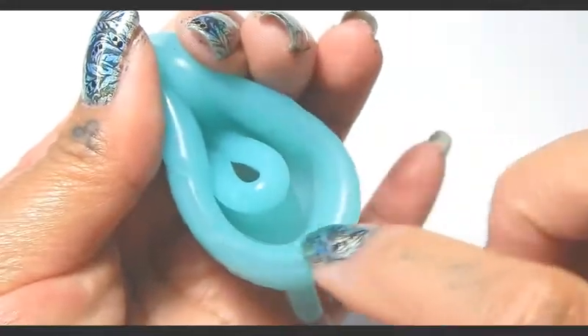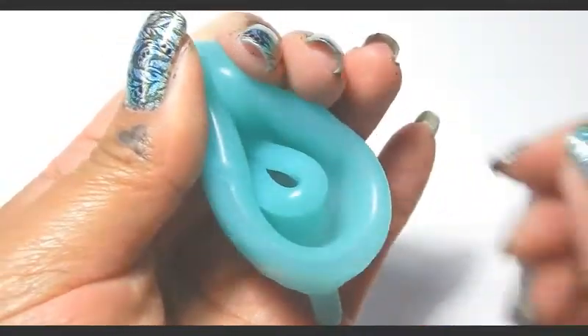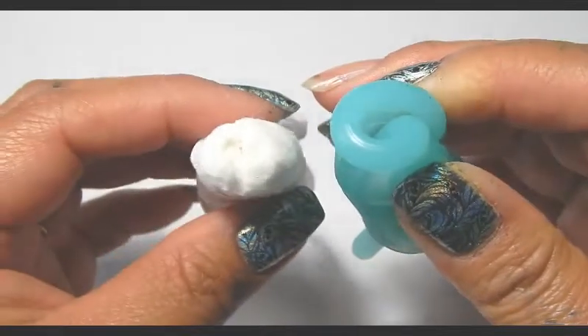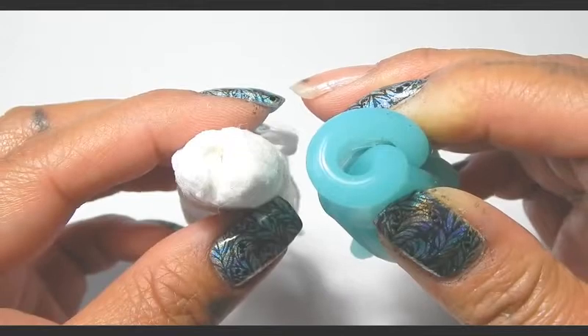So now you have this ring and this ring. Here is the point that would be inserted, and here it is against a super plus tampon for size comparison.